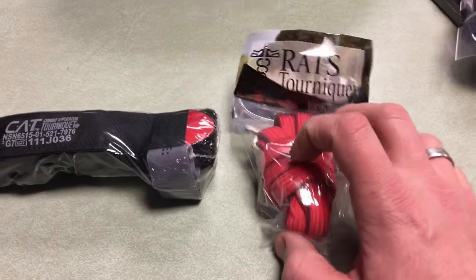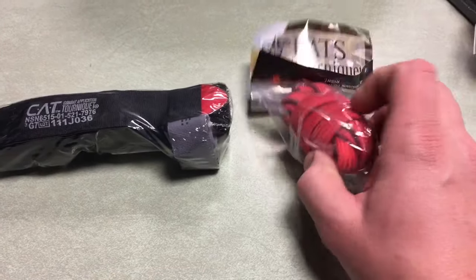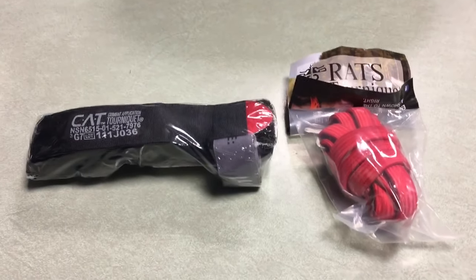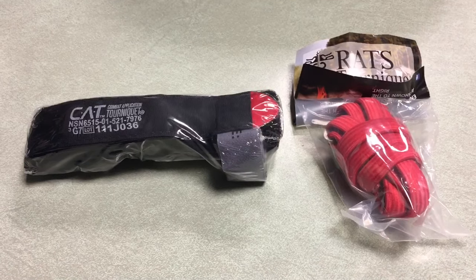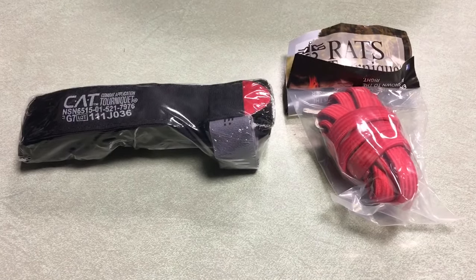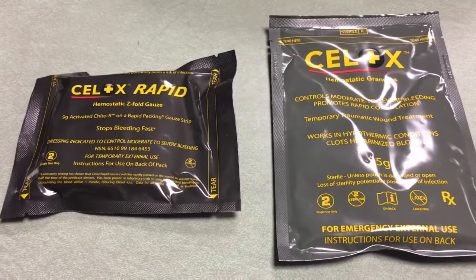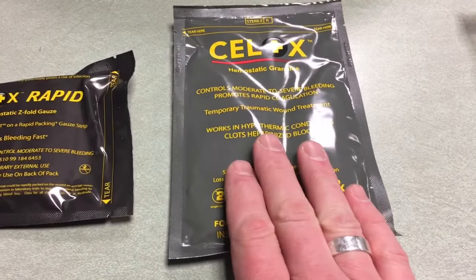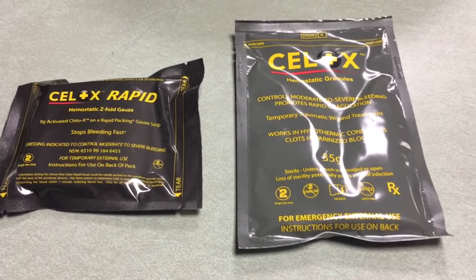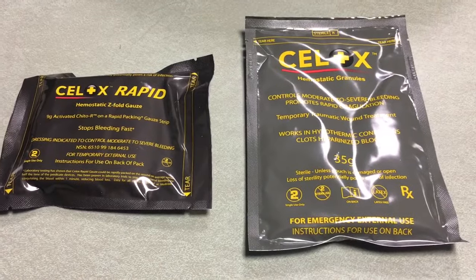Next up, we have two tourniquets. I'm familiar with the RATS tourniquet, and this is the CAT — Combat Application Tourniquet. I've tested the RATS out before, not in a bleeding situation, just to get more familiar with it. My recommendation for anyone wanting to learn about tourniquets is to head over to Skinny Medic on YouTube — he does a great job describing how to use these things. Wild Hedgehog Tactical also included Celox hemostatic gauze and hemostatic granules, which you actually pour into the wound. A lot of gear here for major bleeding situations.